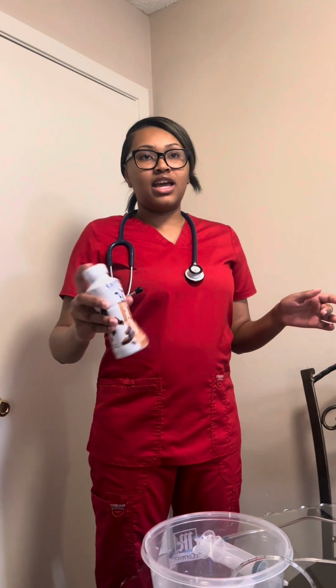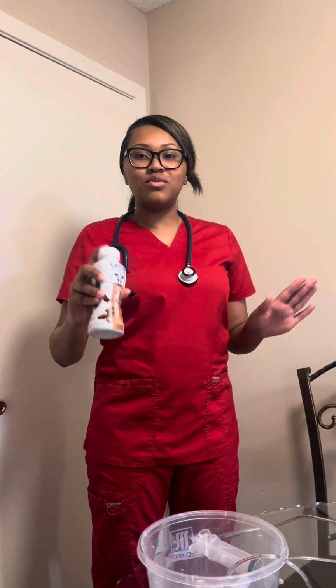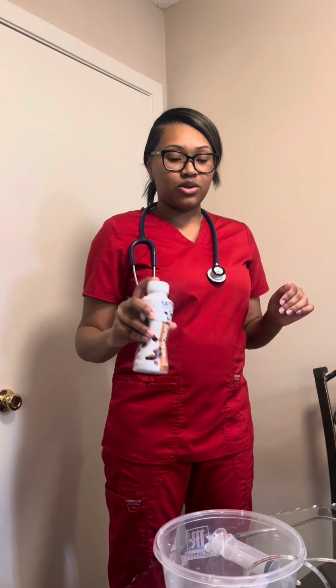And when I come back to reassess, if it's still more than 250, I would also check for abdominal distension, and I would notify the doctor. If it's less than that, then I can continue the process, but at a 50% rate of what I was initially starting with. So next, I would get this, and I would shake it, not so much because you don't want to put air in the patient's stomach, which could be very uncomfortable.